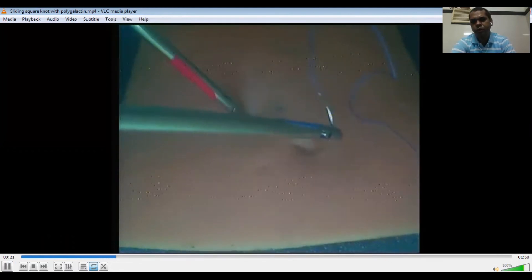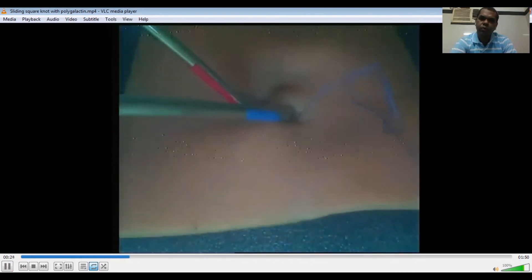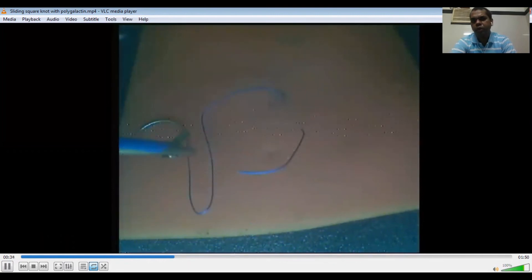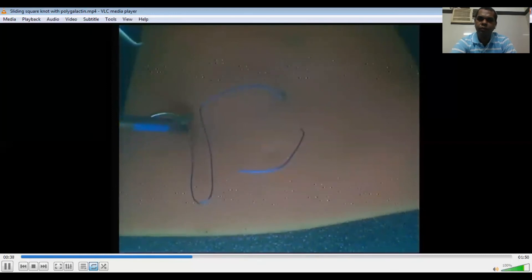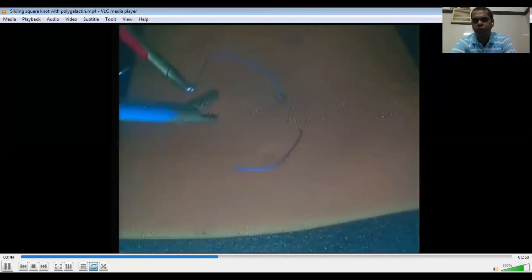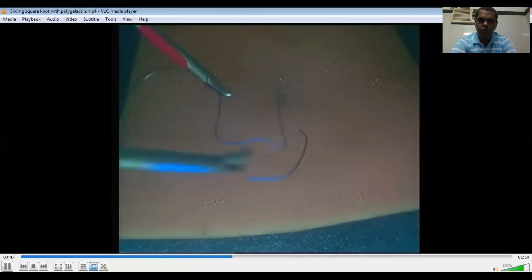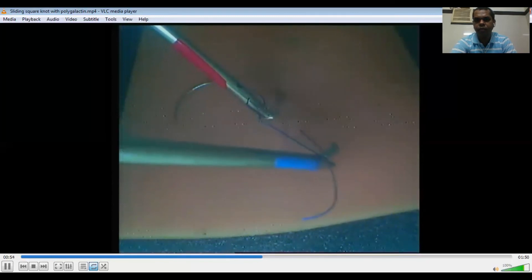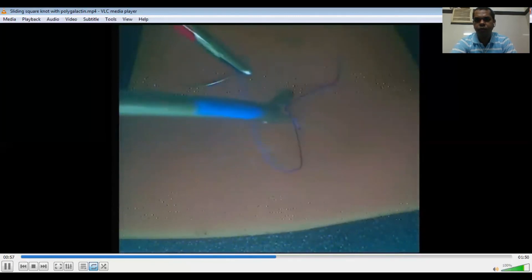Sliding square knot. This video demonstrates the sliding square knot with polygalactin number one suture. The needle is loaded with the point A-B-C technique. The needle is passed through the suturing pad from right to left. In laparoscopic suturing, one has to be ambidextrous — one should be able to suture with both right and left hands. Now I will be demonstrating the C-loop technique. The long tail is held with the left needle holder, and this is first the under wrap.